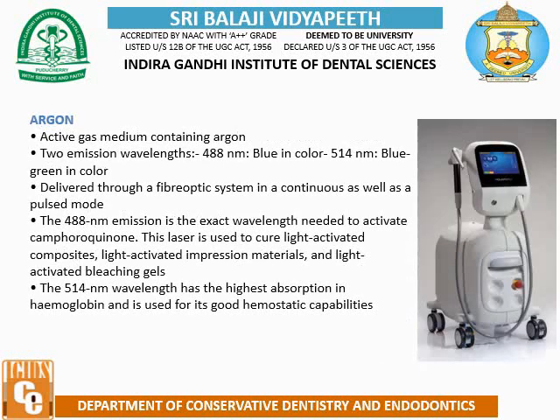Argon. Active gas medium containing argon. Two emission wavelengths: 488 nanometer, blue in color, and 514 nanometer, blue green in color. Delivered through a fiber optic system in a continuous as well as pulsed mode. The 488 nanometer emission is the exact wavelength needed to activate camphoroquinone. This laser is used to cure light activated composite, light activated impression material, and light activated bleaching gels.